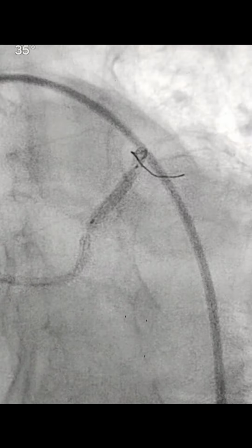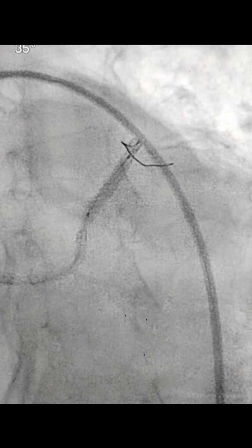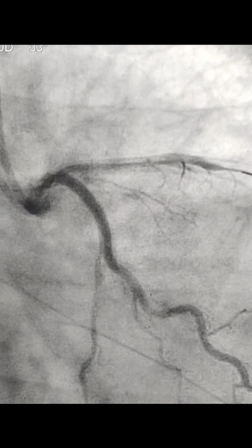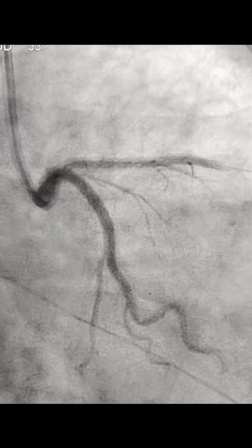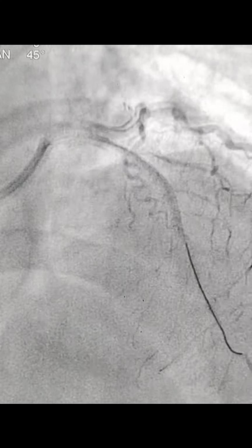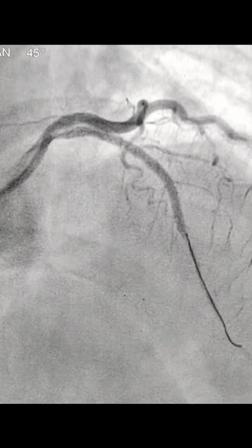Again, we did the placement of the stent from the ostium, and we deployed the stent here. And this is a picture after the deployment of the stent, and then we have done the overlapping with the mid LAD stent. This was the overlapping of the stent. And this is a picture after the stent deployment from the ostium, and you could see mild haziness in the ostium again. So we have given tirofiban and everything.